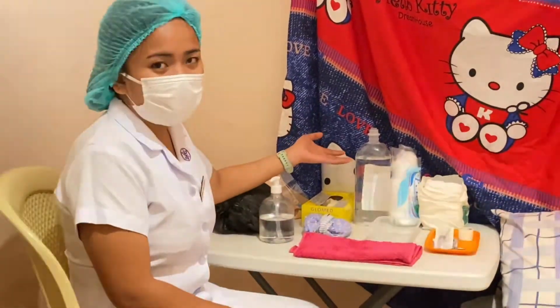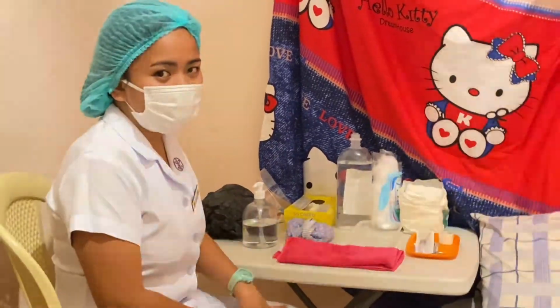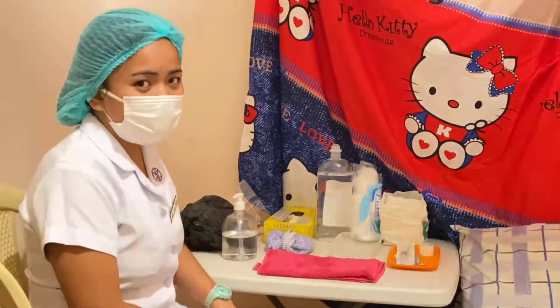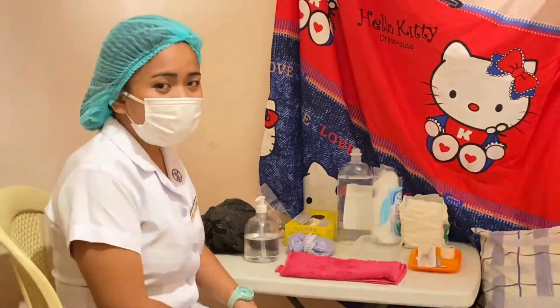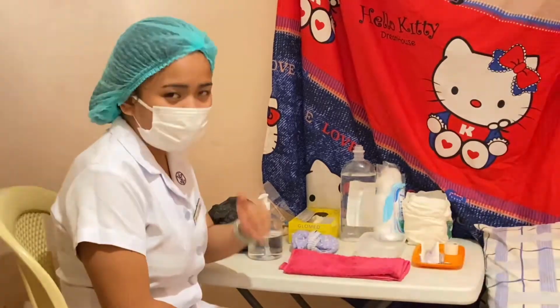So here we have a normal saline solution. The type of solution that will be used during the wound dressing will depend upon the doctor's order. So for my patient, the doctor ordered a normal saline solution that will be used later during the irrigation or the cleansing of the pus or exudates.